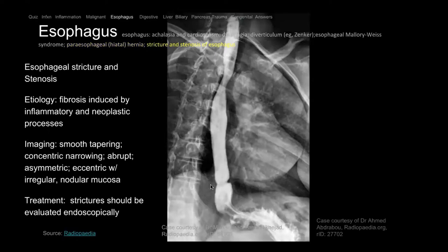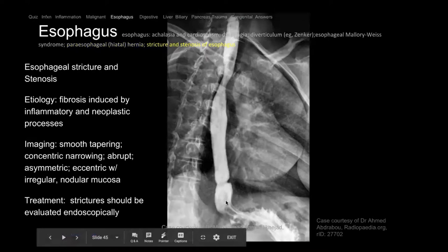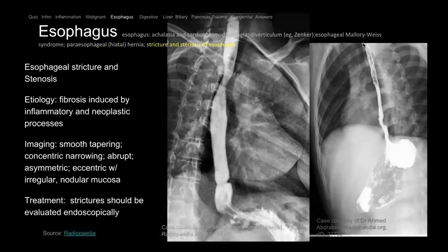Here's another example of a stricture — a web — on esophagram showing the distal esophagus with a waist causing dysphagia. This is commonly from a reflux stricture in the distal esophagus. If it's Barrett's, it could be more proximal at the transition point between metaplastic and normal epithelium. Here the esophagus shows abnormal — instead of normal distension, it's a straight narrow pipe — a long segment stricture that can happen from radiation, prior NG tube placement, or ingestion of caustic material like lye.